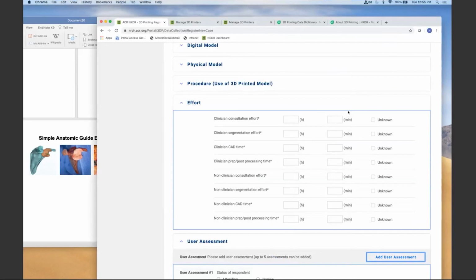At the end of the day, one perspective is that the registry is interested in knowing how much work was required to create a particular case. If a particular case done by particular individuals required a certain amount of time, then that's what these fields are intended to collect. If practitioners were more or less experienced in a particular case, these fields don't address that question. Ultimately the presumption is that those individuals involved in making the case were qualified to do so, and that these effort fields just summarize the amount of time that was spent. It's a good question, and again potentially a lot of heterogeneity there.